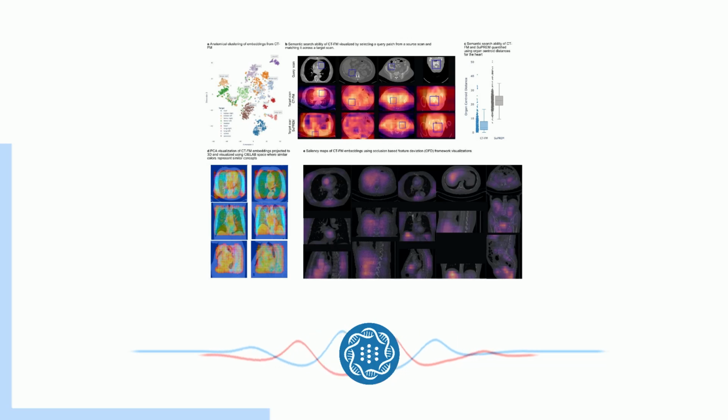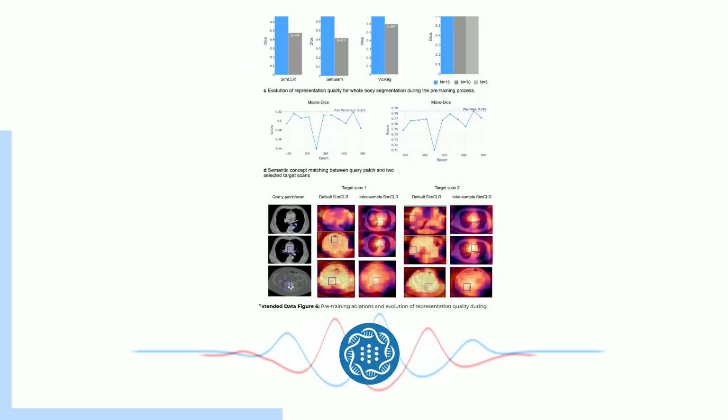Right, exactly. And this approach actually allowed CTFM to outperform even the specialized models, especially when it came to these segmentation tasks. So it's not just about recognizing what things are. Right. It's understanding where they are and how they're shaped within the body. Yeah. That makes sense. And this focus on fine-grained detail is what allows CTFM to be so good at those tasks, like identifying those really hard-to-see tumors in your blood vessels, or accurately outlining the boundaries of a tumor for surgery or radiation therapy.